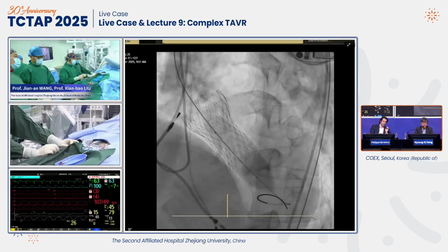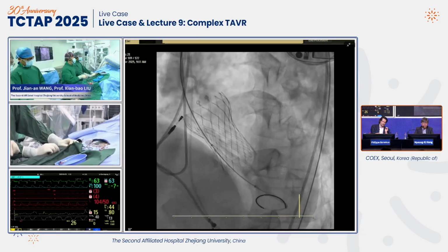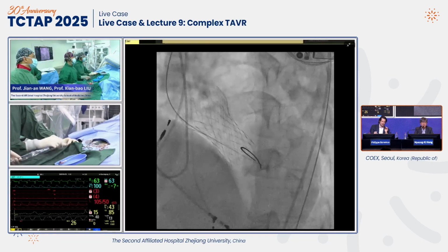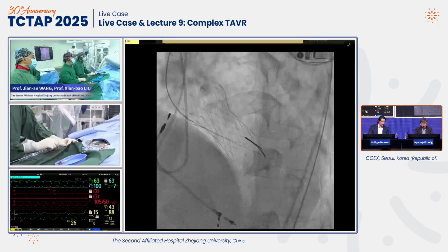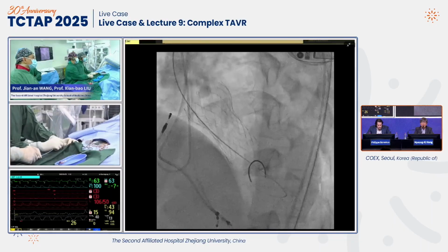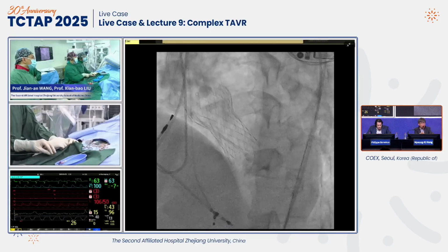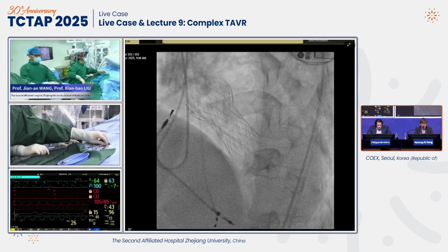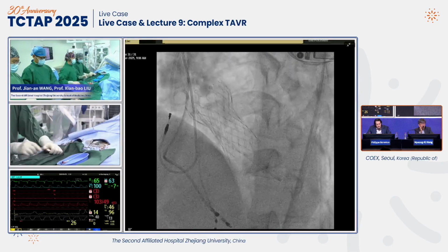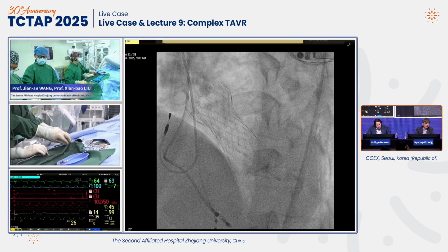You can see the calcium. I don't know if you broke the raphe, but you can see the calcium just got pushed to the side. You see here it is vertical, completely vertical. The waist of the valve in the system is dramatically increased and expanded, and the calcium was moved to the outside. It's a very dramatic image.